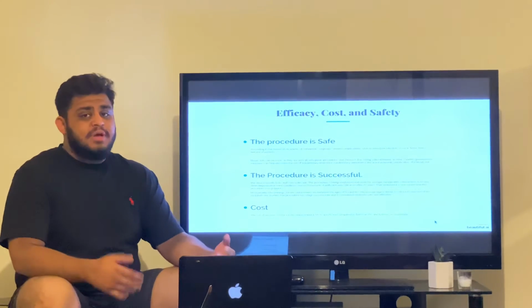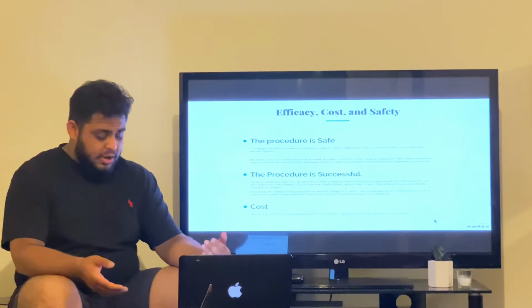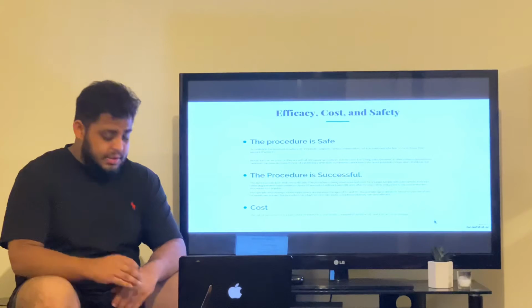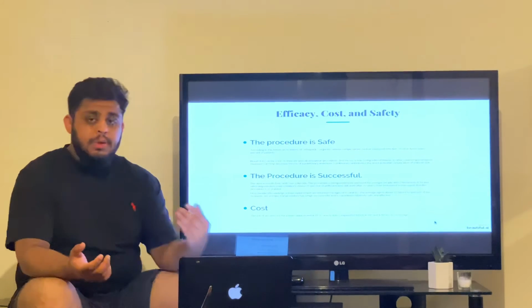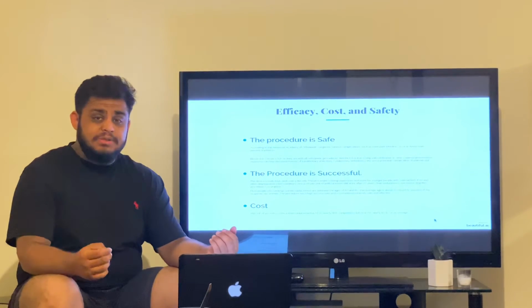These knee prostheses have been used in younger people due to osteoarthritis or any other degenerative knee conditions. 85% of these knee prostheses still work after 20 years. Most of the people that go through this surgery are between the ages of 50 to 80, with the average age being 70. And 60% of the recipients are female.